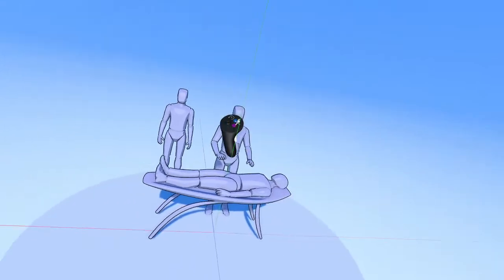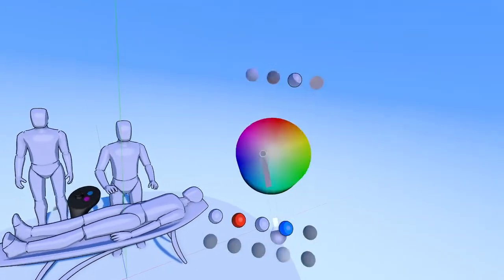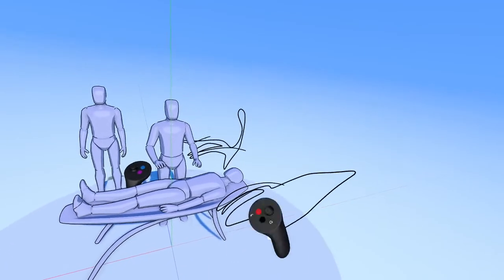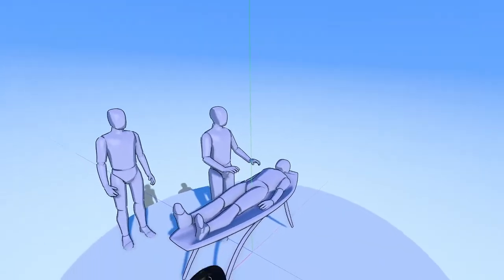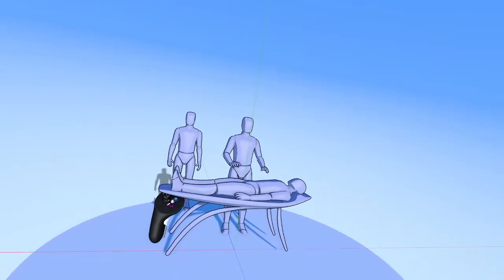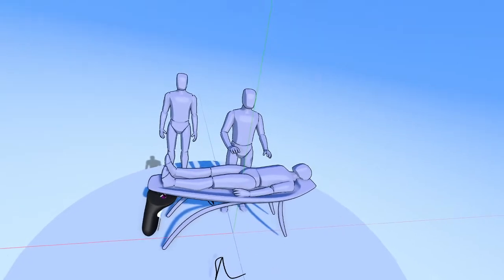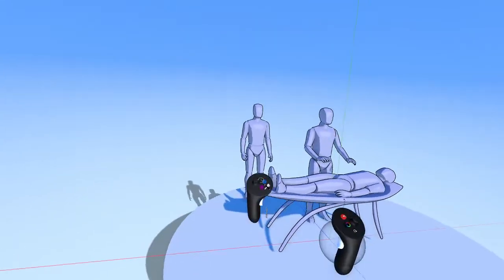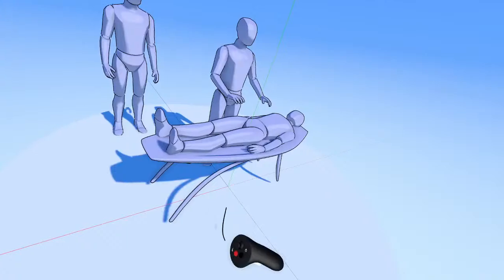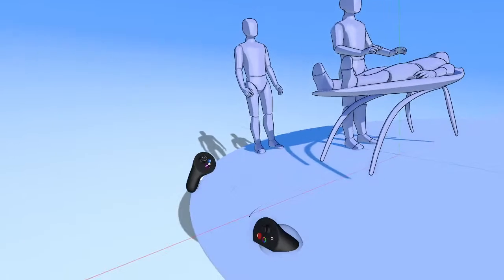Now we can sketch our robot. Let's go to the ink tool here, again purple tools menu, ink tool, and let's make this a nice dark black color so we can really see these lines. Let's start sketching the idea of this robot, what it's going to look like. I'm trying to think if I want to do this symmetrically or not. Yeah, it's probably best to do it symmetrically. So we'll sketch it here because this is where the mirror axis is, right? It makes no sense to sketch it over here because all that geometry is not usable. And let's just get some loose ideas down.